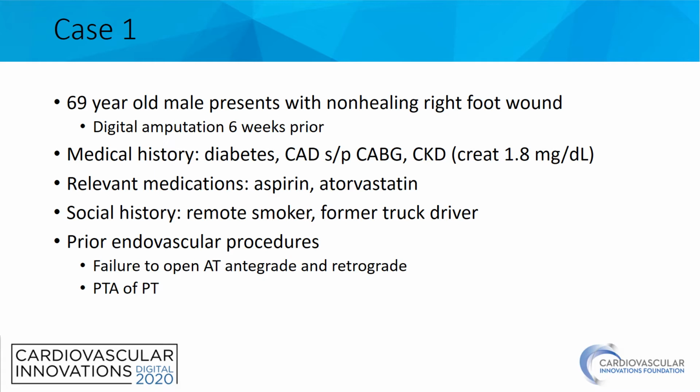Of note, at the outside hospital, he had undergone an attempt to open an occluded right anterior tibial artery, both through an antegrade as well as retrograde approach. That was unsuccessful. And at that same time, he also underwent angioplasty of his right posterior tibial artery.